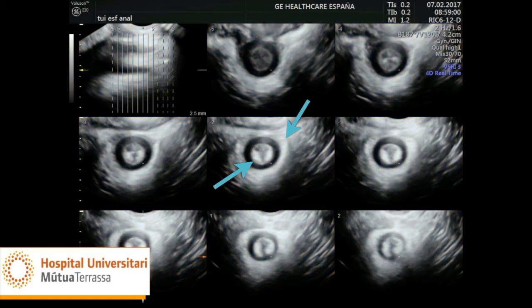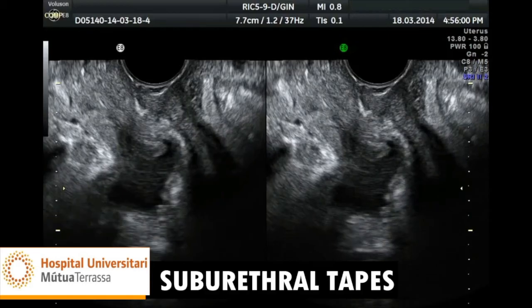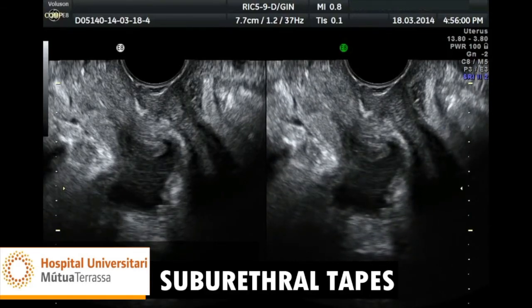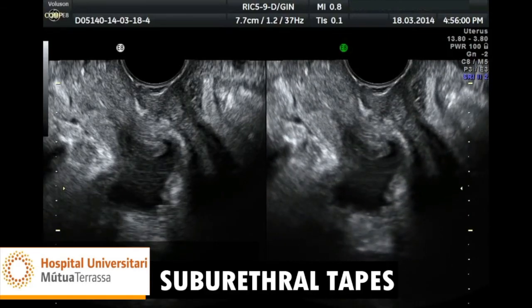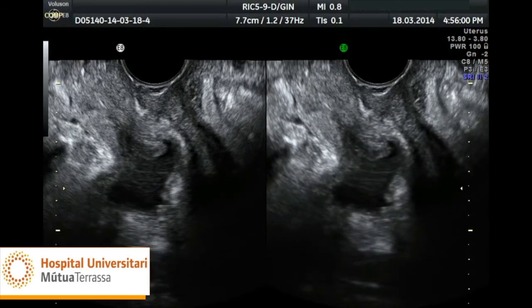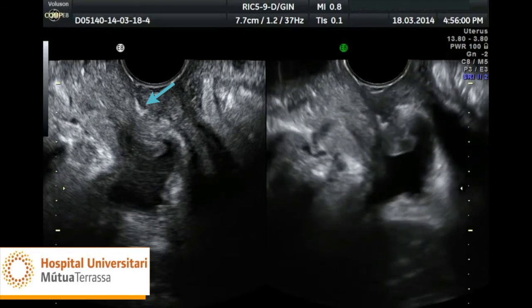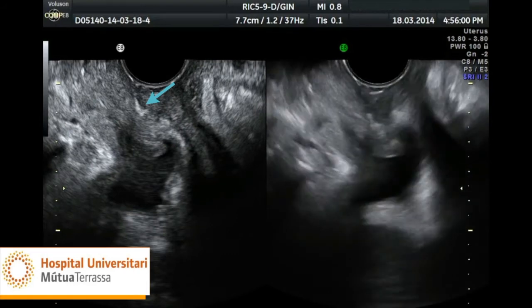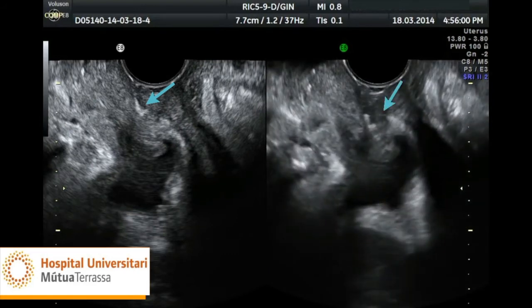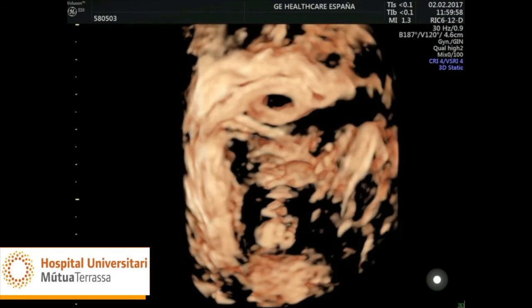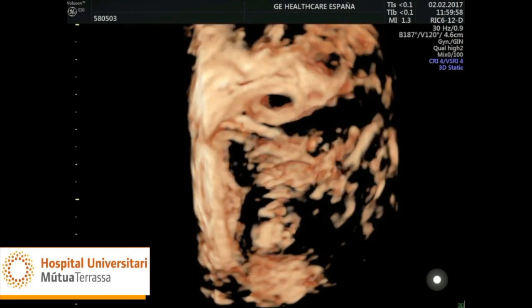Finally, we should mention that ultrasound also allows us to accurately assess the tension-free tape used in incontinence surgery. We can assess this dynamically, as the tape appears hyperechoic on 2D ultrasound and very well defined on the three-dimensional imaging.